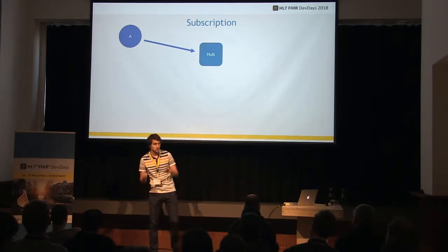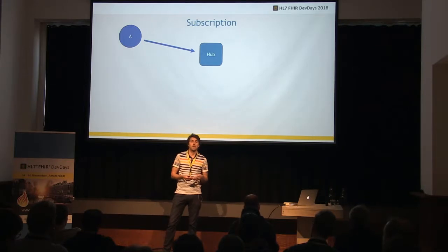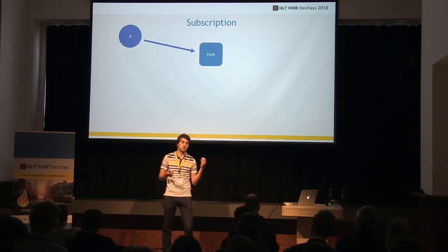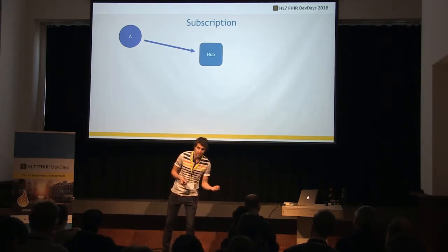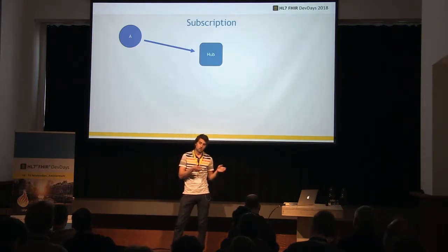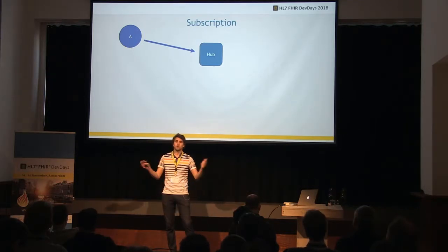A topic can translate to many different things, but a simple way of seeing it is, for example, a workstation. So maybe a topic is equivalent to a workstation. That's the more common case that you have today. But as I mentioned earlier, perhaps in an MDT meeting, it might be something broader than that.